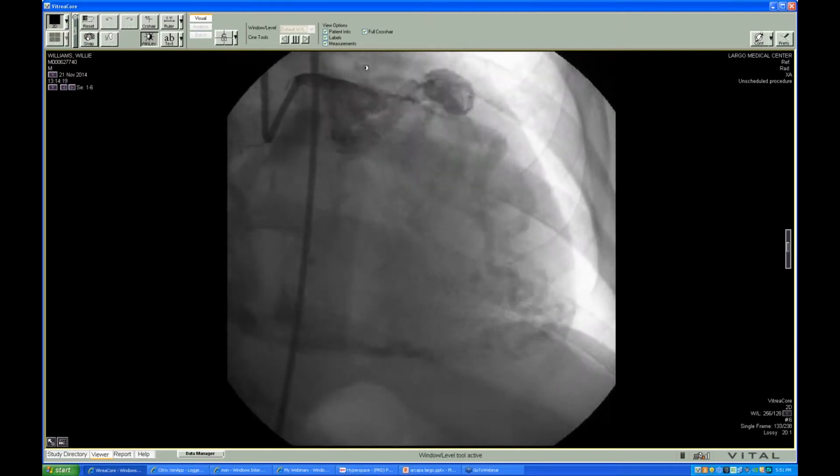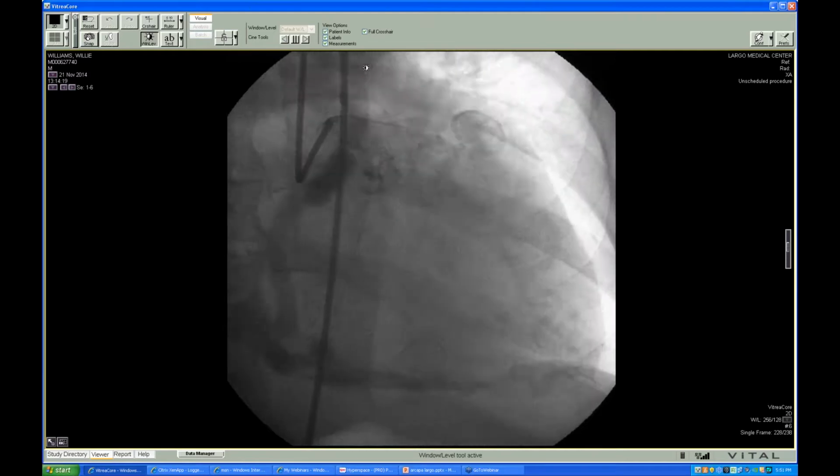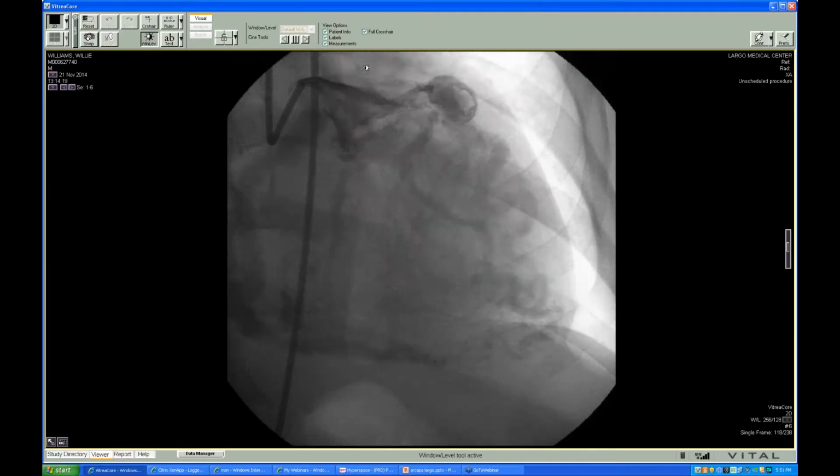Paolo, can you put a vascular plug in the right coronary artery from the pulmonary artery? I tried, and I put a catheter.